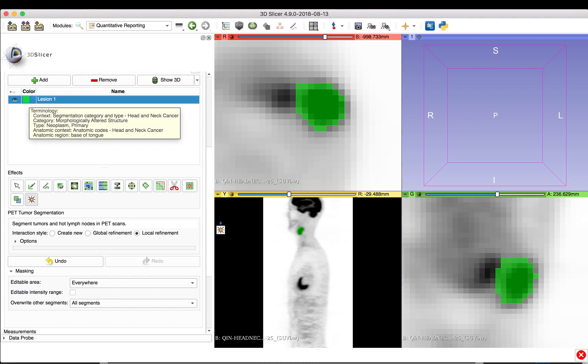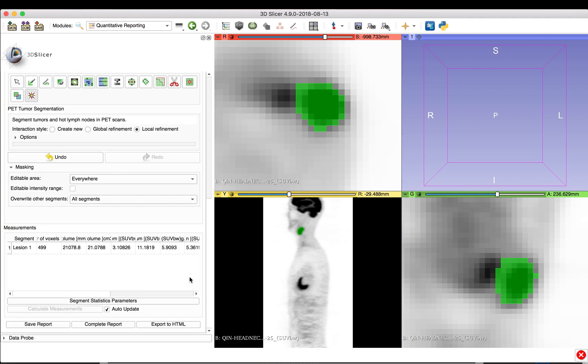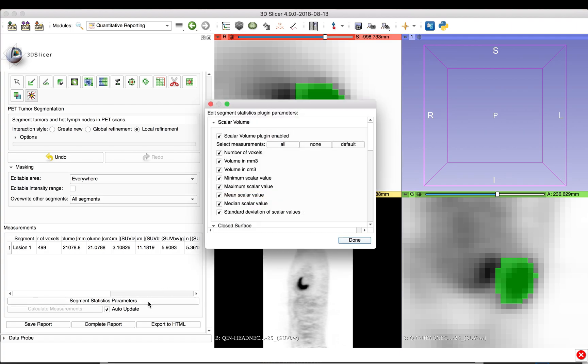Once a lesion segmentation is completed, the quantitative reporting module will automatically calculate a set of quantitative indices and list them in a table at the bottom of the module. You can configure the set of indices to calculate using the Segment Statistics Parameters button.